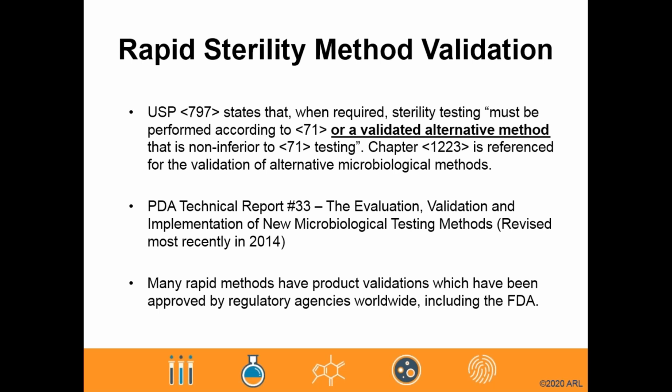To address one question that often gets asked, that is, does my state board allow for rapid sterility testing? Currently, we are only aware of one state board that does not accept an alternative sterility method, and that is California.